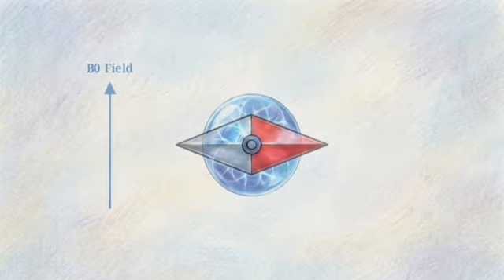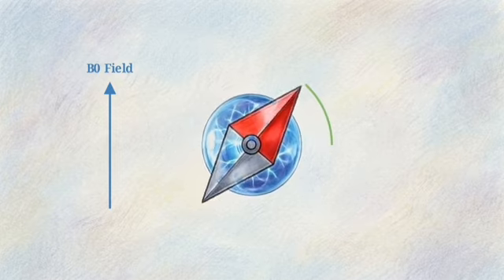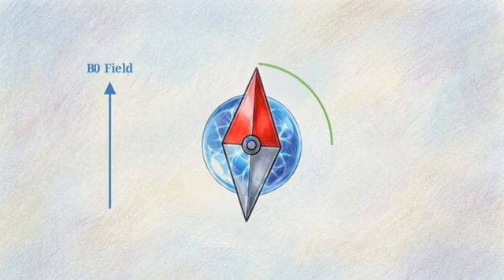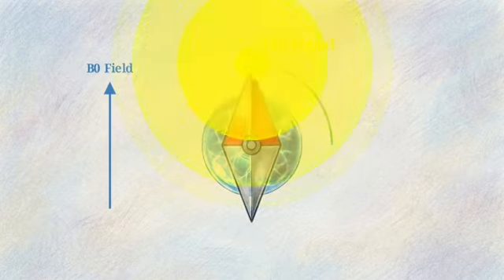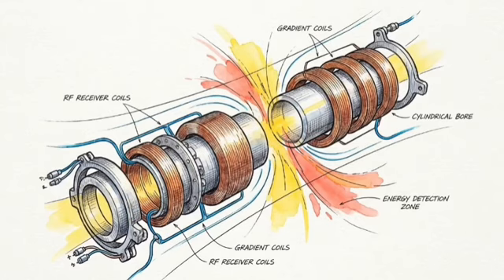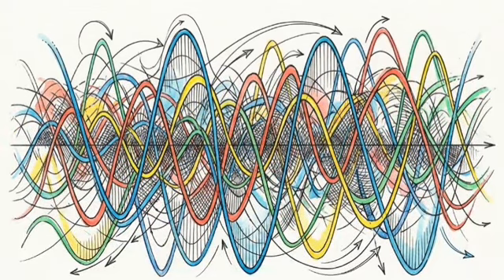Left alone in the massive magnetic field, the protons immediately begin to relax, snapping back into their original alignment with the main magnet. As they relax, the protons release the radio energy they just absorbed, emitting it outward as a tiny radio signal. Specialized receiver coils built into the MRI machine detect these tiny returning radio signals, capturing a phenomenon known as free induction decay. By carefully choreographing this absorption and release of radio frequency energy, the MRI briefly turns the silent water molecules in our tissues into active radio transmitters. The body is now emitting millions of overlapping radio signals at once.